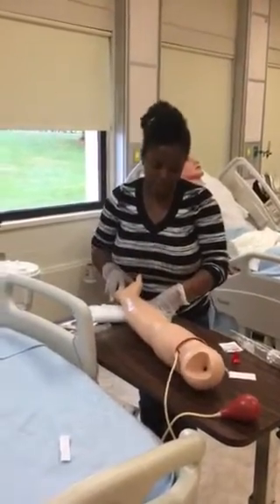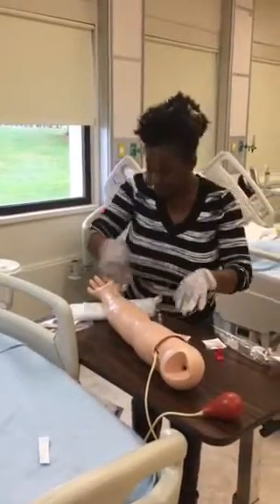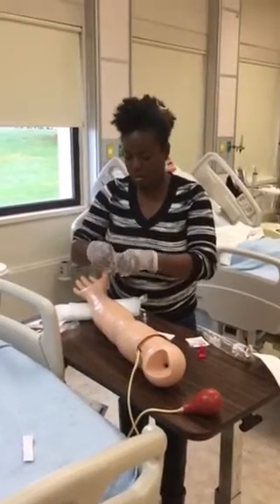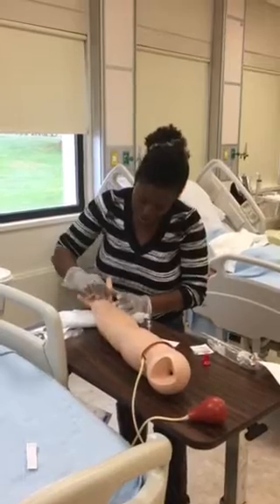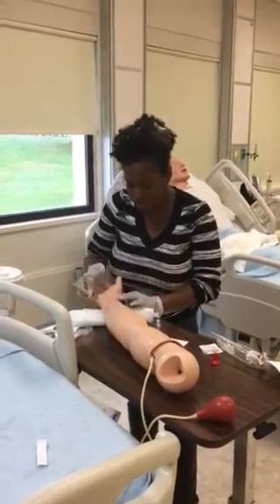I place a towel under the patient's arm to hyperextend the patient's arm, and I'll tell Mr. John I'm gonna clean my site. Also clean my gloves.